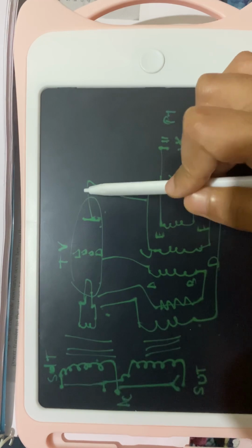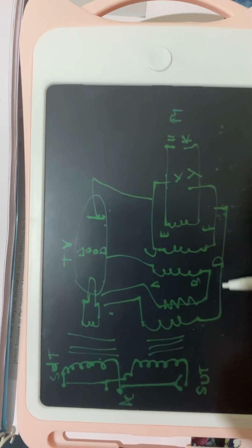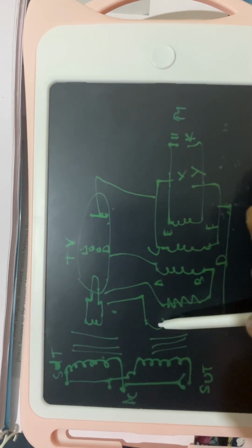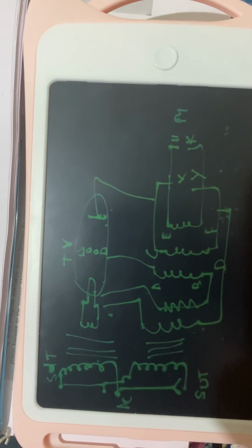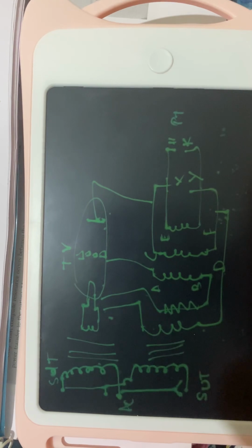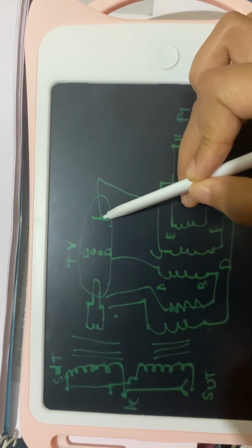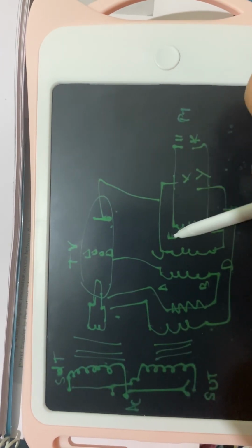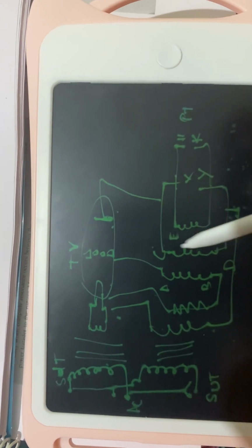This anode carries the current through the oscillator circuit. Through the oscillator circuit, it is connected back to the secondary coil of the step up transformer and back to the filament. This is how the pathway looks. When current flows from the cathode to the oscillator circuit, current flows through this coil CD.